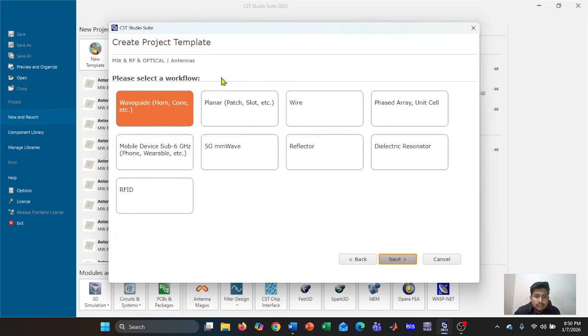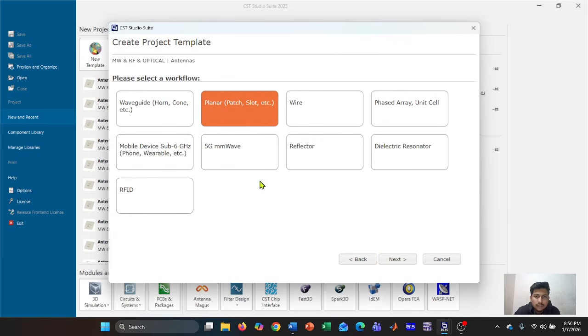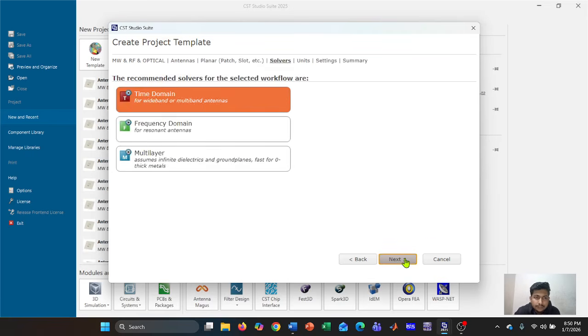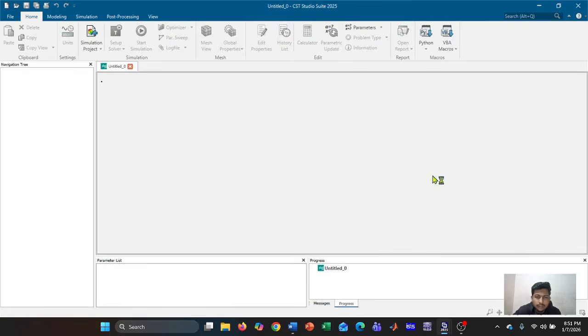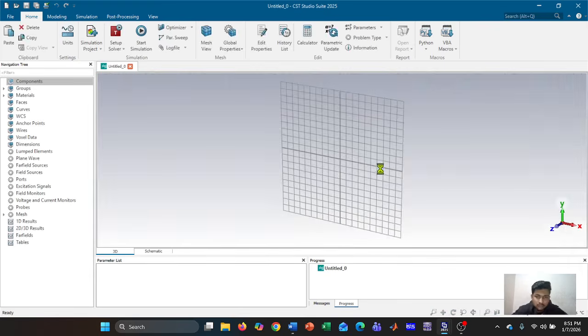Next, I am going to design a planar patch type antenna, so I will be choosing the planar time domain. Next, for the frequency range of 0 to 3 gigahertz, I'm going to get the results of E field, H field and far field. And at 2.4 gigahertz, I will put the frequencies 2.4, 2.45. You can put anything, 0.9, 0.915, 0.202. Okay, click next.